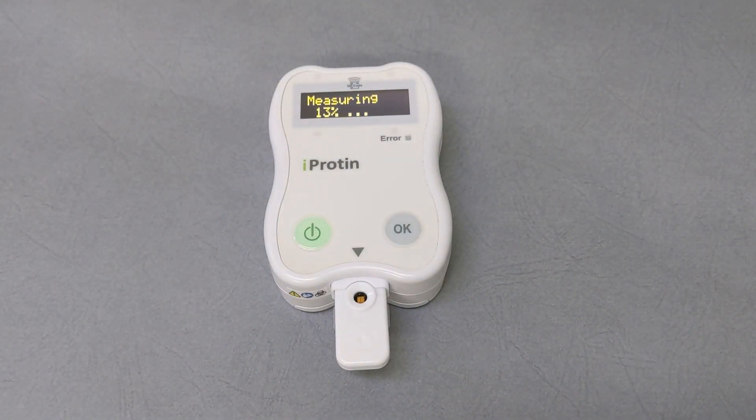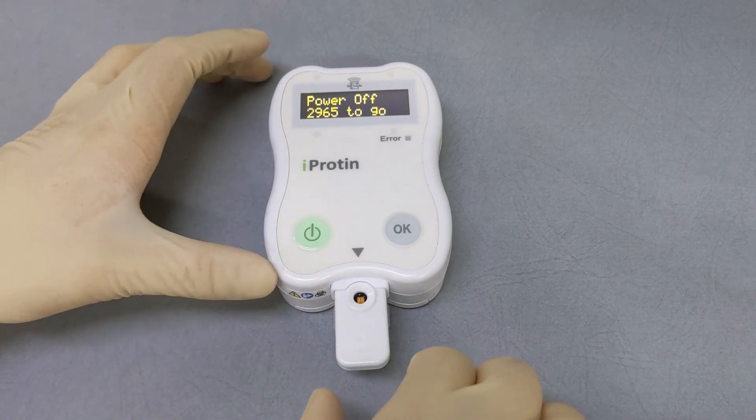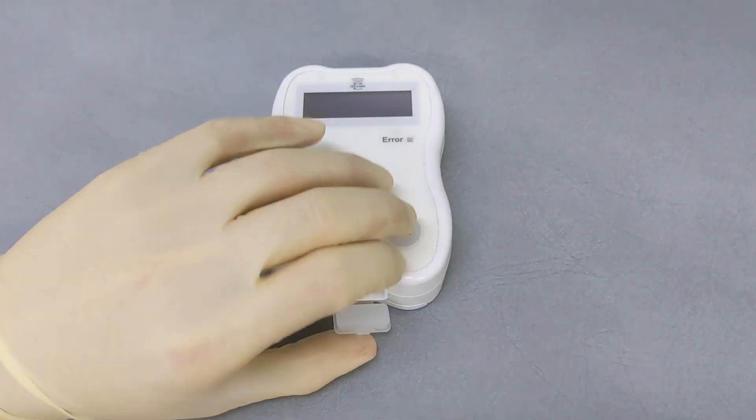After the sample is dropped, the measurement will start automatically and the monitor will show the result at the end of the test. After completing the measurement, remove the assay cartridge and press and hold the power button to turn off the iProtein reader.